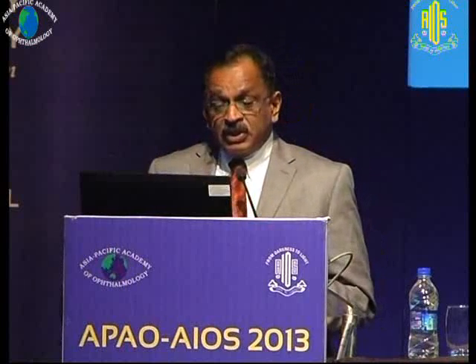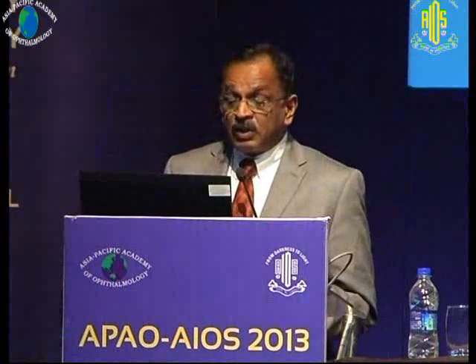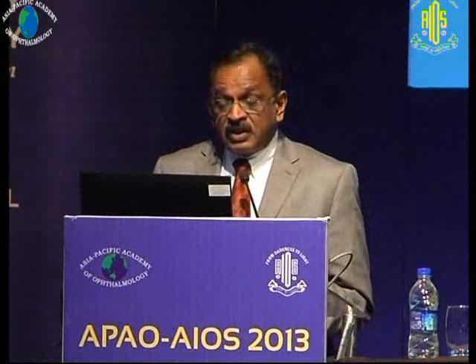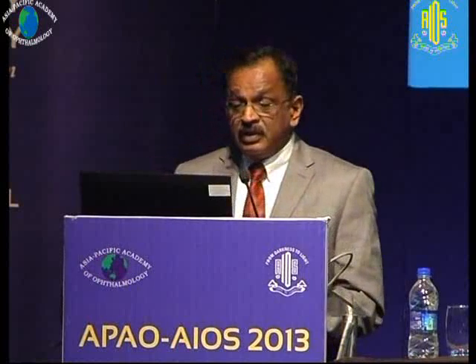The drainage retinotomy is most commonly done preferably in the superior nasal quadrant, where you could tamponade it easily. Especially, you would do a posterior drainage retinotomy only in the cases of a pre-existing anterior retinal tear.